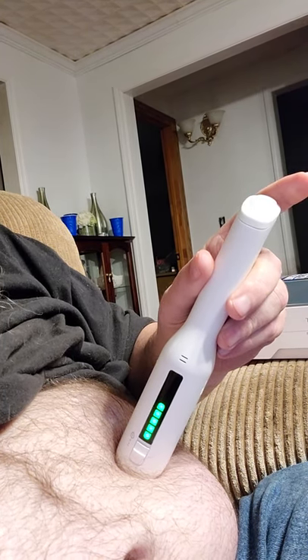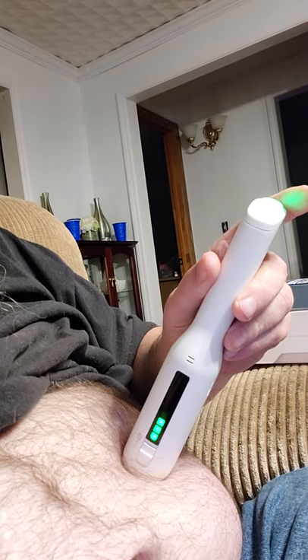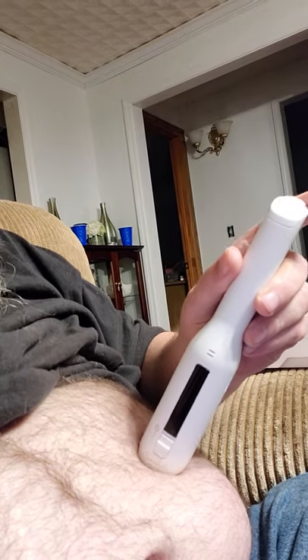We hit the button. Oh, that really feels bad — that hurts bad. No pain, no gain.